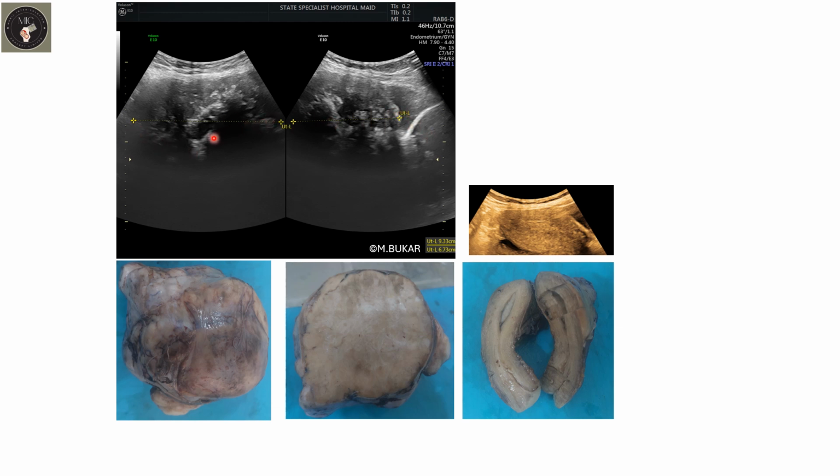And here, look at these bright lines and dots. Look at this tip of the iceberg sign, which to me suggests that this could be a case of mature cystic teratoma. But at surgery, look at this. Lobulated, yes, we have seen that. Here you can see the whole appearance. This is the tip of the uterine fibroid. Here you can see the bright edge of the endometrial polyp, and you see the polyp here.